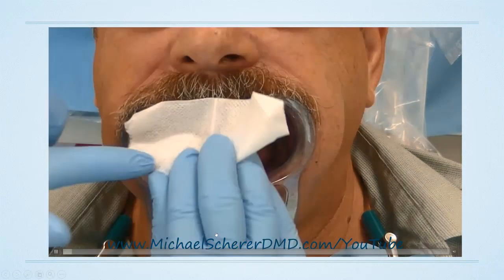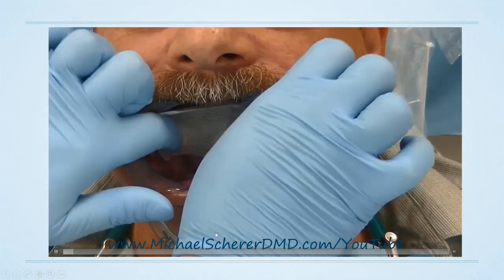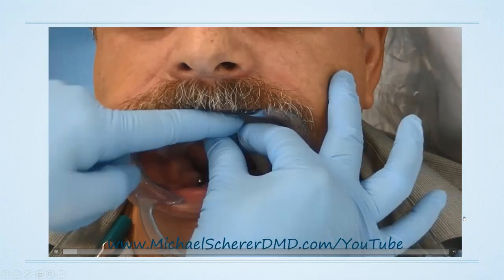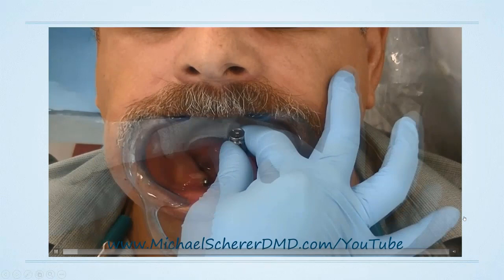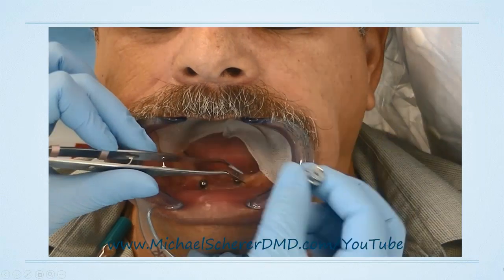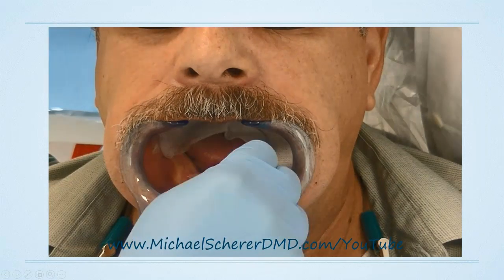So the general workflow: this is just a video off of my YouTube channel. Feel free to go check it out. But what I'm going to do is just go step by step. First step is I remove the healing abutments, exposing the implant underneath.